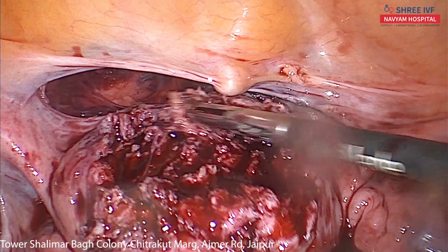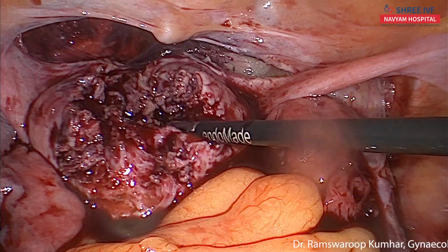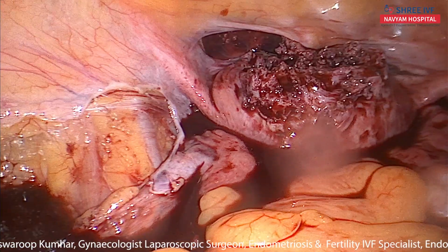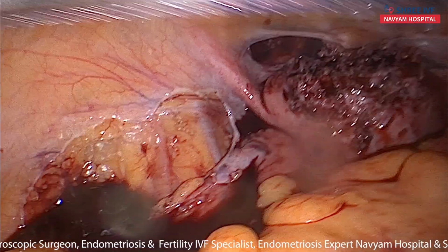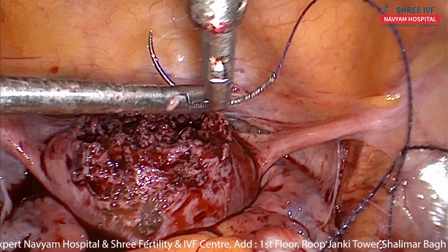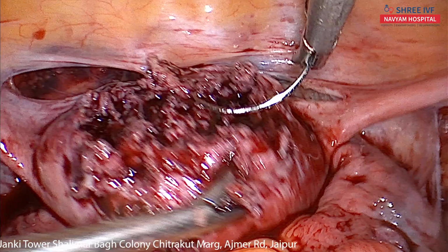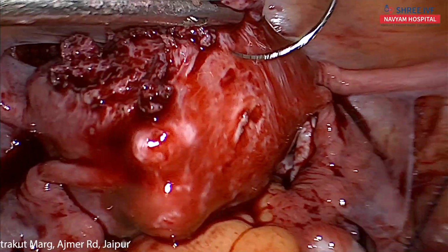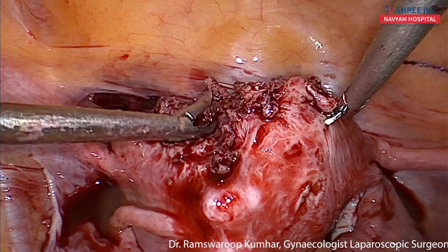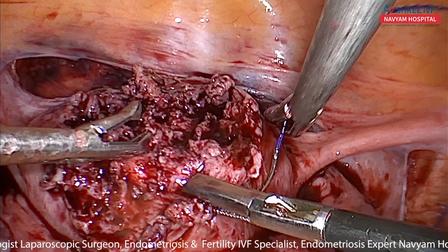Now, Stratafix, we will suture it with number 1 Stratafix. Now putting the suture inside. The suture is inside. And we will take deep sutures in single layer.